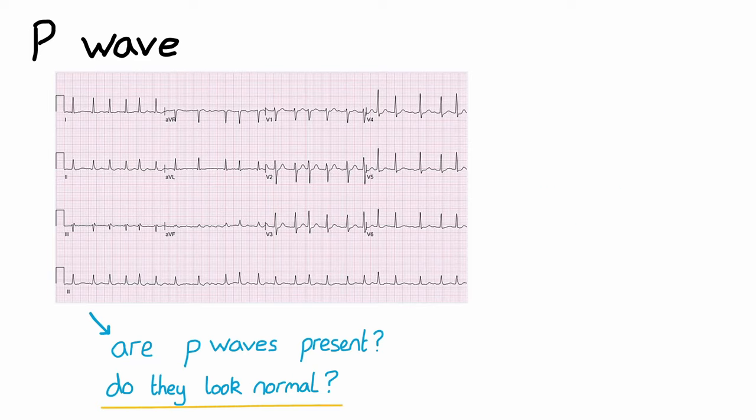Finally, morphology—that is, does it have a normal shape? We can see in this ECG there's a slurred upstroke at the start of the QRS complex. This is called a delta wave, and it's abnormal. You can see this in Wolff-Parkinson-White syndrome.